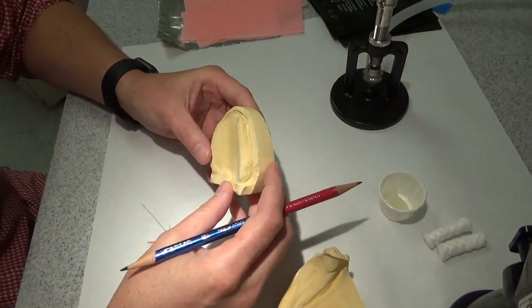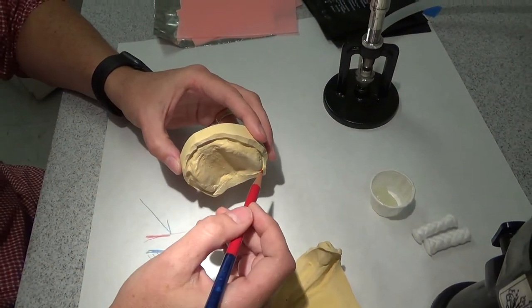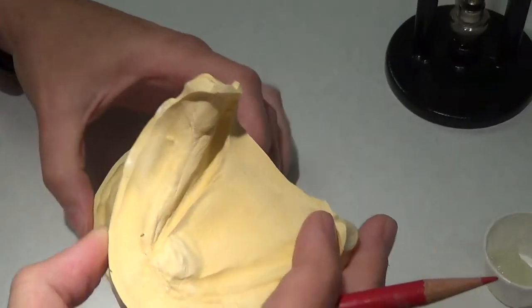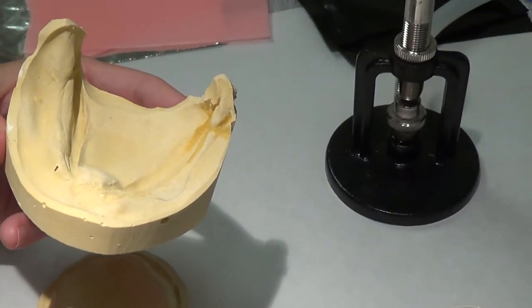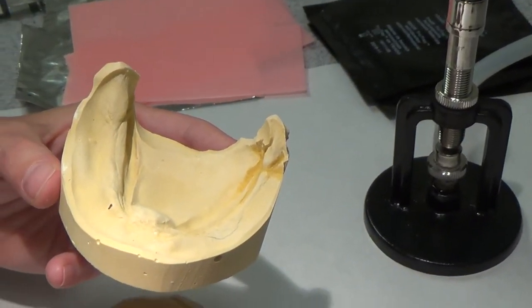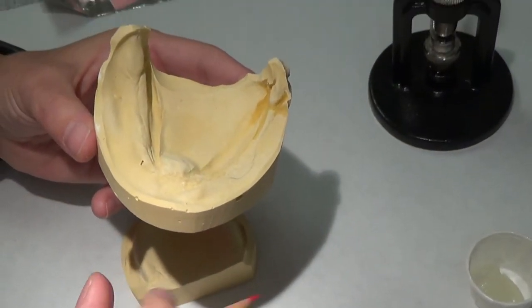I'm dealing with a patient that has not a very tall ridge, especially on the mandible. When we look at her mandible, it's flat. What's going to resist that displacement? How is my denture going to be stable and retentive?